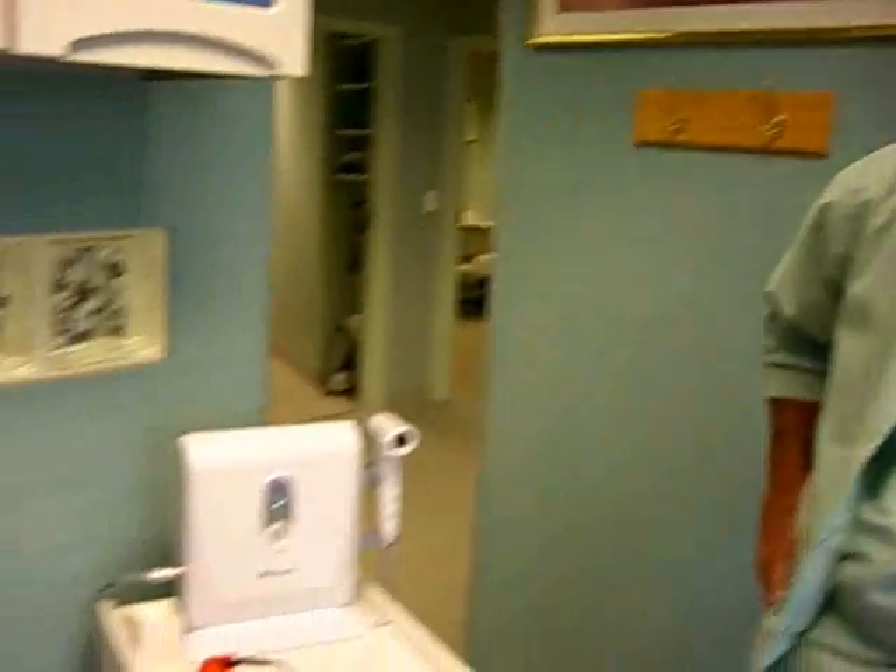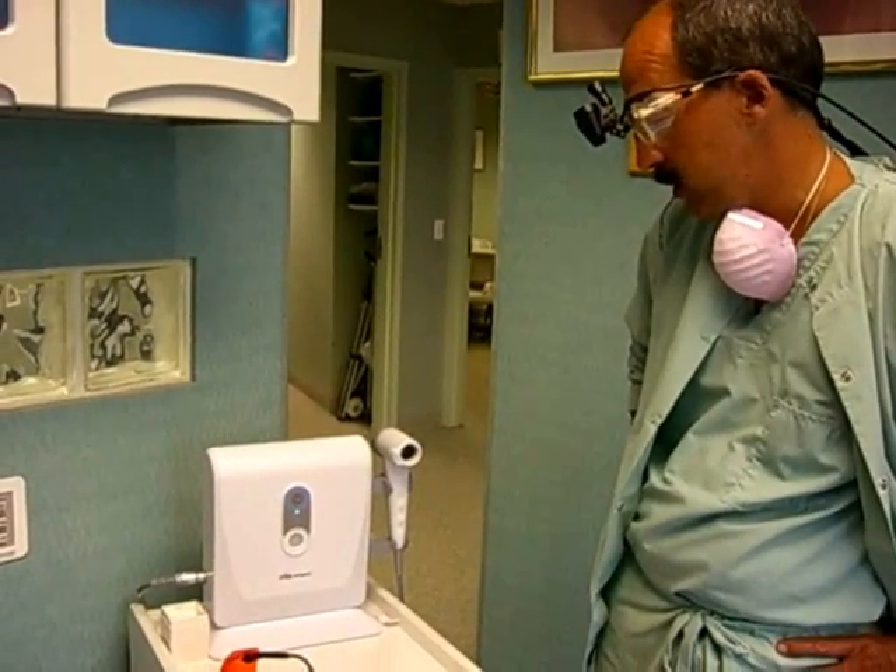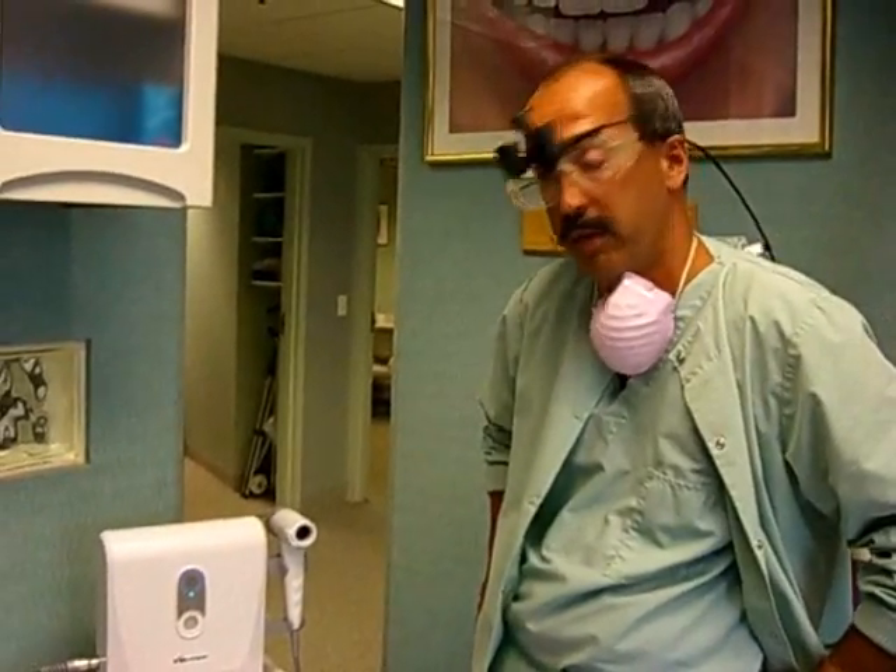Hi, I'm Dr. Jamberdino. We're here to talk about the Velscope, a new piece of equipment we have in our office. We use it for screening for oral cancer in the mouth.